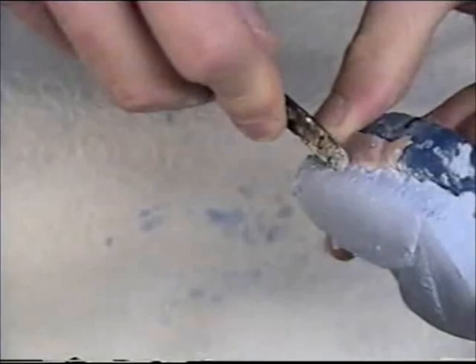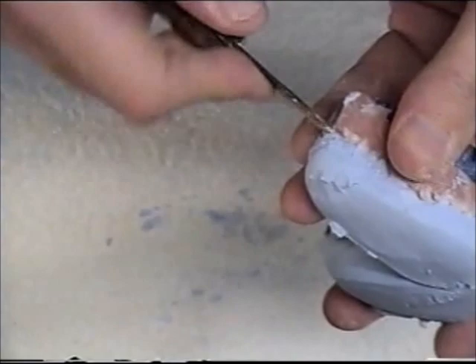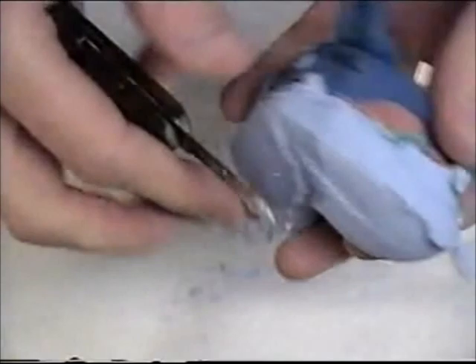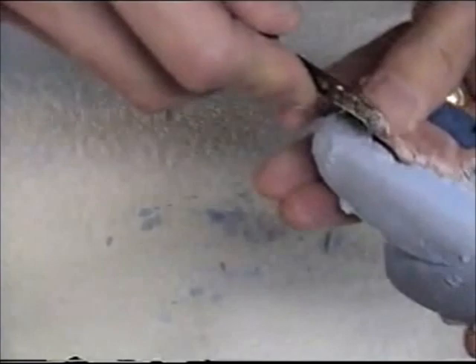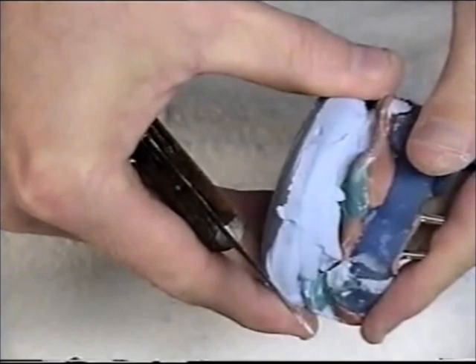I really would like to keep the impression material inside the tray here. I don't really want to pull that apart in case I have to reference back to it. So we're going to have to take a little time here. If you ever have trouble separating the stone from your impression material, you can pour water in between the two. That helps some. Now it looks like we're coming along well here.